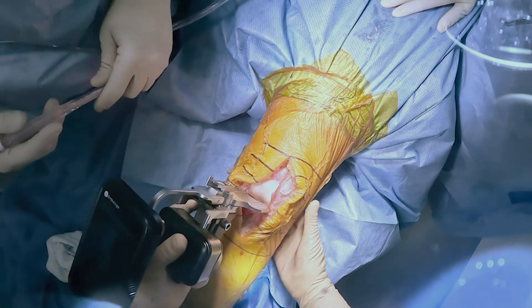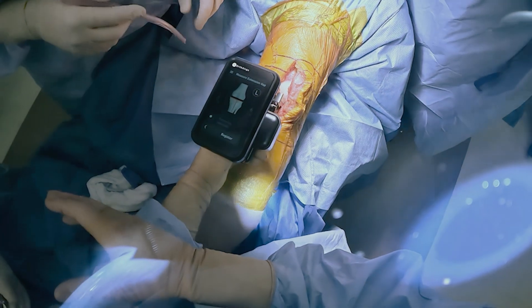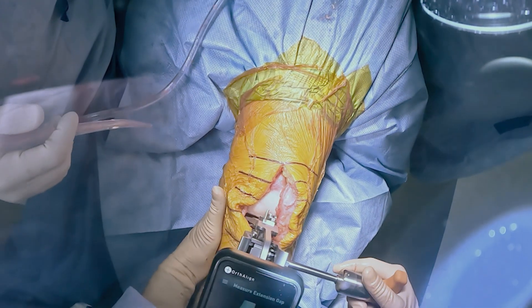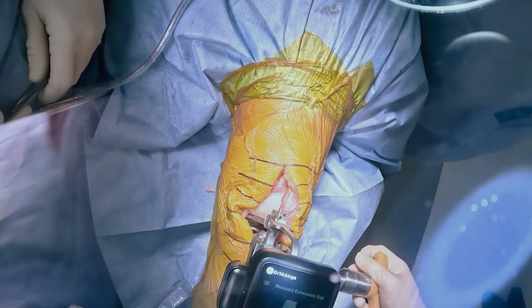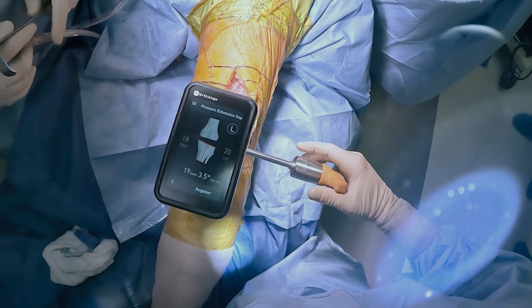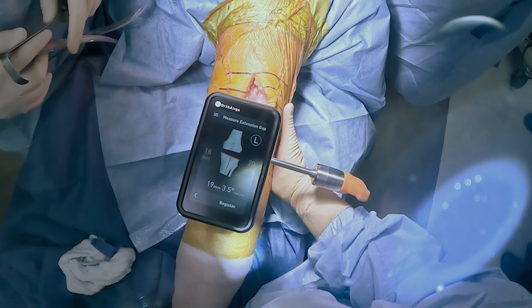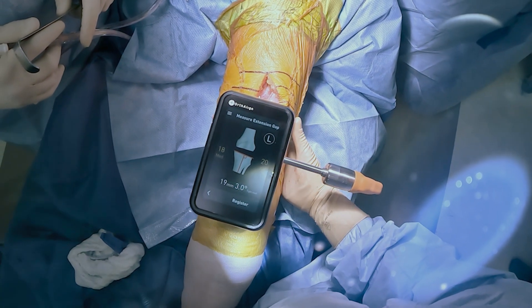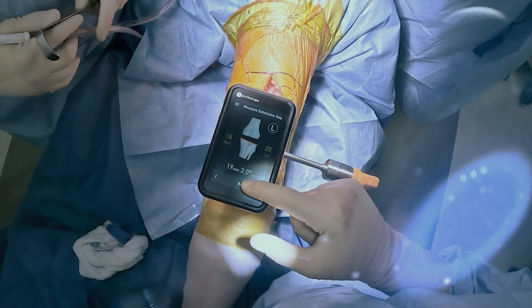After I make my distal and proximal cuts, the lantern allows me to gap balance appropriately. Previously, I would use a spacer block and go by feel with this step. However, this actually quantifies the numeric values of the medial and lateral gaps, which gives me a better idea of what I'm working with. In this case, the medial compartment is tighter than the lateral compartment, approximately 18 to 20, which signifies that I can maybe release a little bit more medially. I generally do this earlier on in the procedure with the lantern technology.